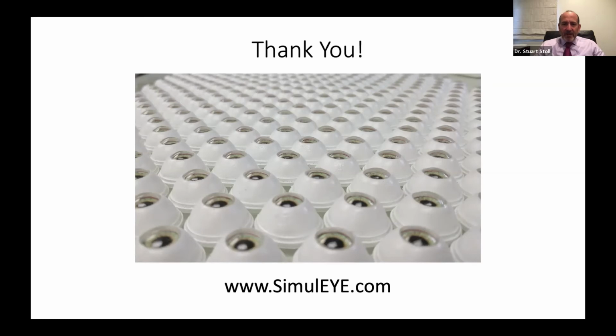Here's a question: for how long can a simulator be used? Well, ours doesn't have much of a shelf life problem. It can sit around for months. The polymer clay might start to dry out after about 3 or 6 months, but that's pretty easily attainable. You can get more, and you can put it on the shelf and revisit it a month later, or after you've had some experience, you can come back to it and practice.